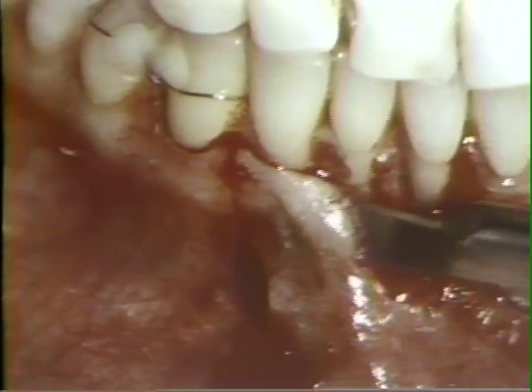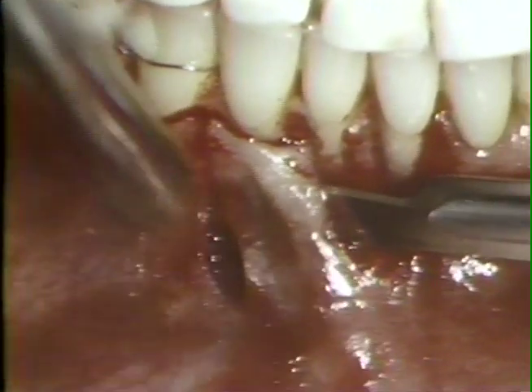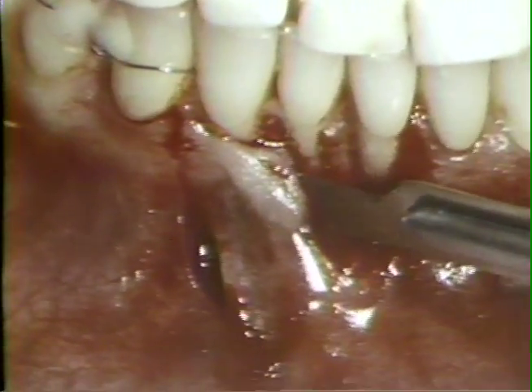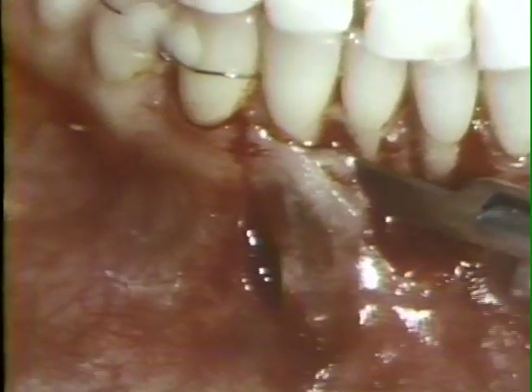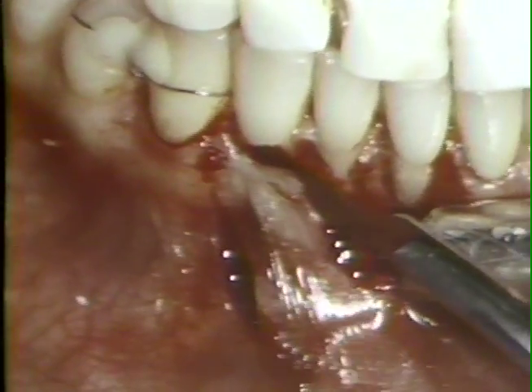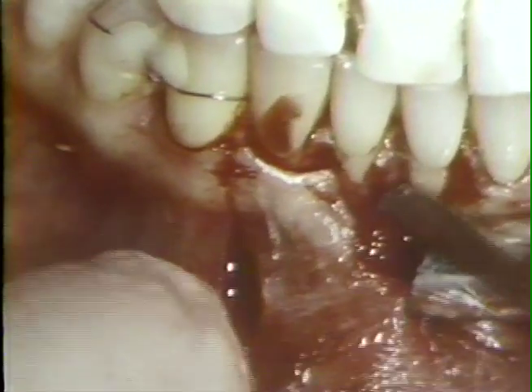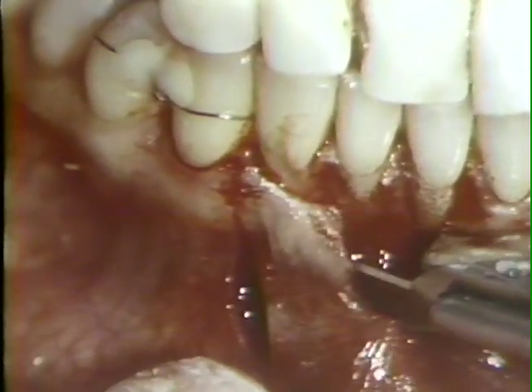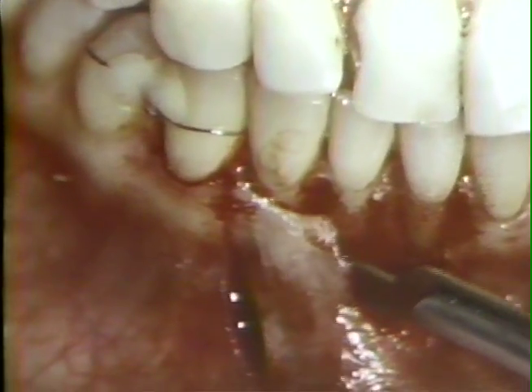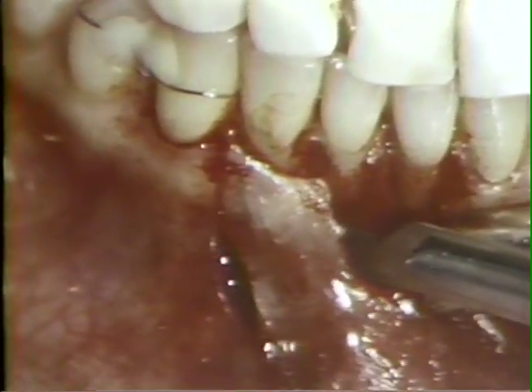Healing is facilitated because the periosteum covers the bone, and some of the fiber apparatus is left embedded in the cementum of the teeth. The dissection progresses from an apical to a coronal direction. Care is taken not to perforate the flap with the scalpel blade. Obviously, a periosteal elevator could not be used because a full thickness flap would expose bone at the donor site.